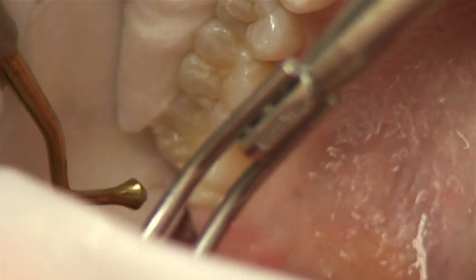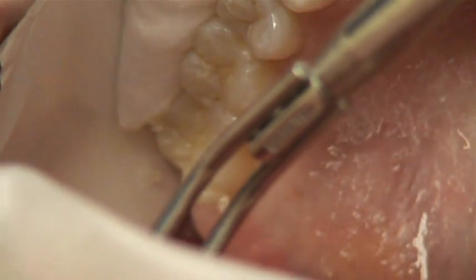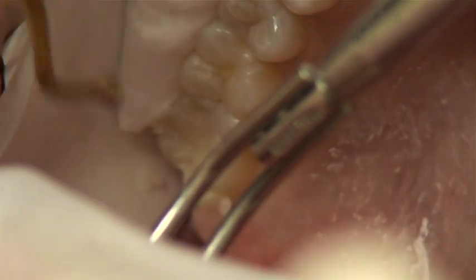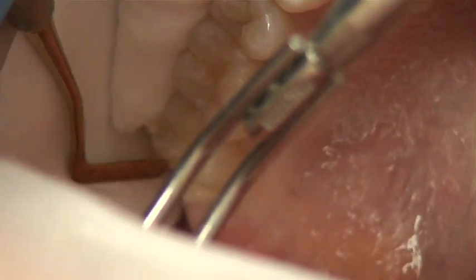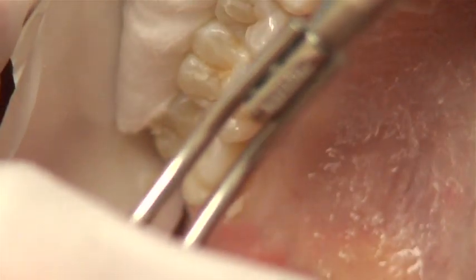So we place the acorn, drag it to the side, wipe off the excess, place it in the center, do one stroke, and within a few seconds, as you can see, we can develop the morphology very well, including the marginal ridges, and it's very efficient.